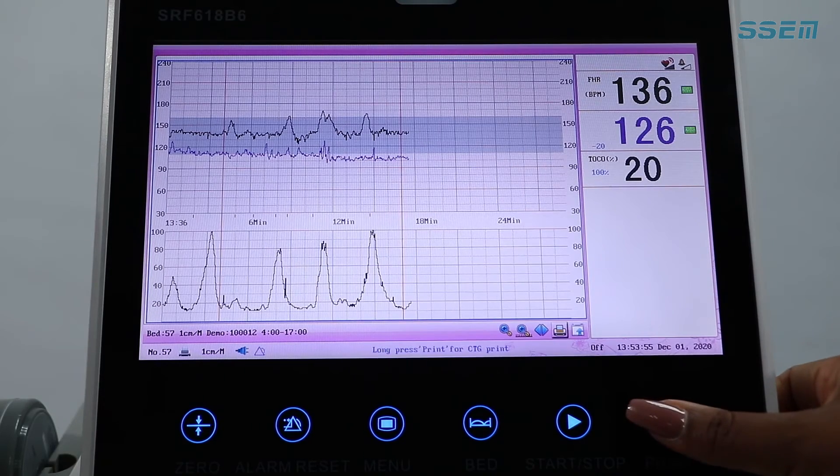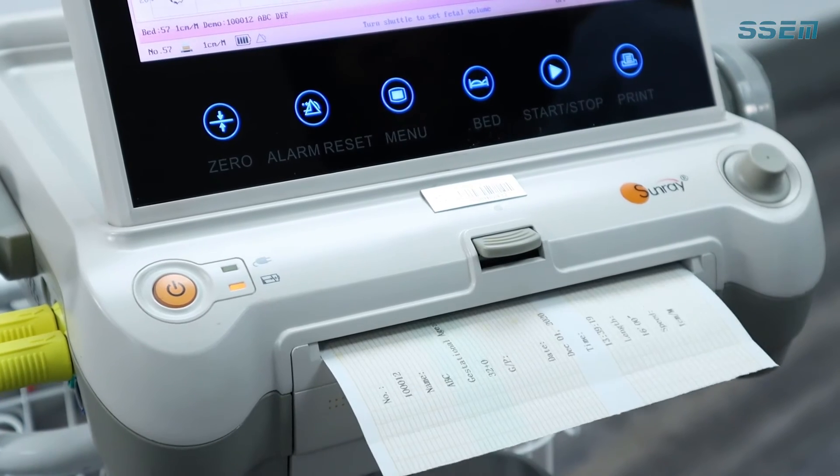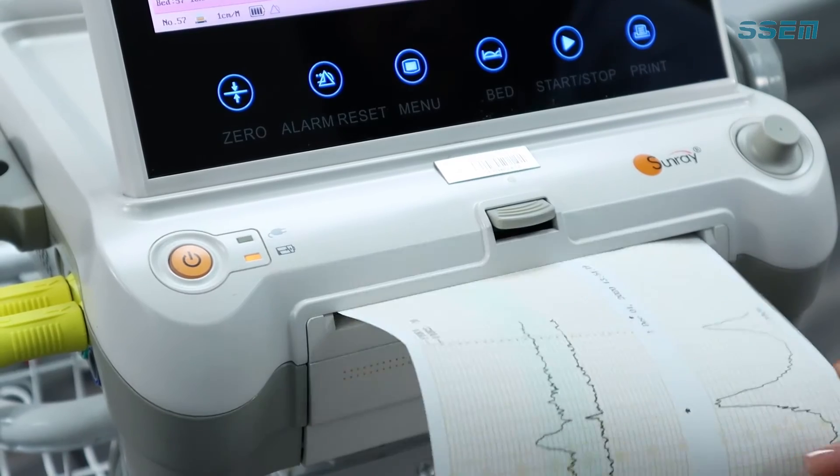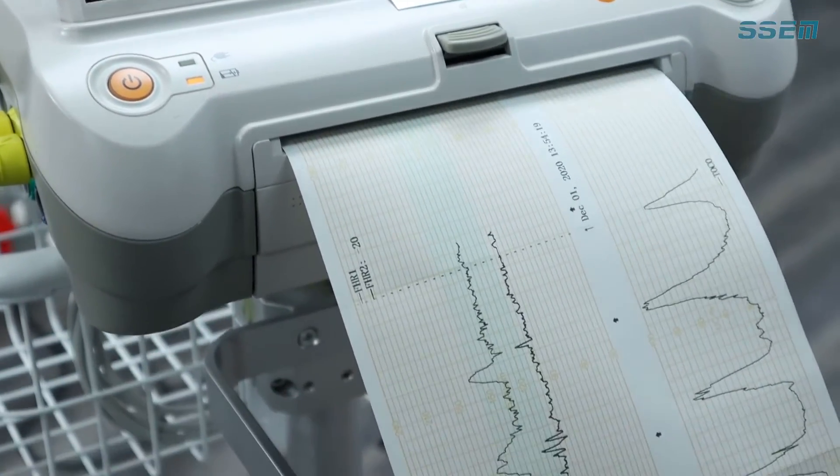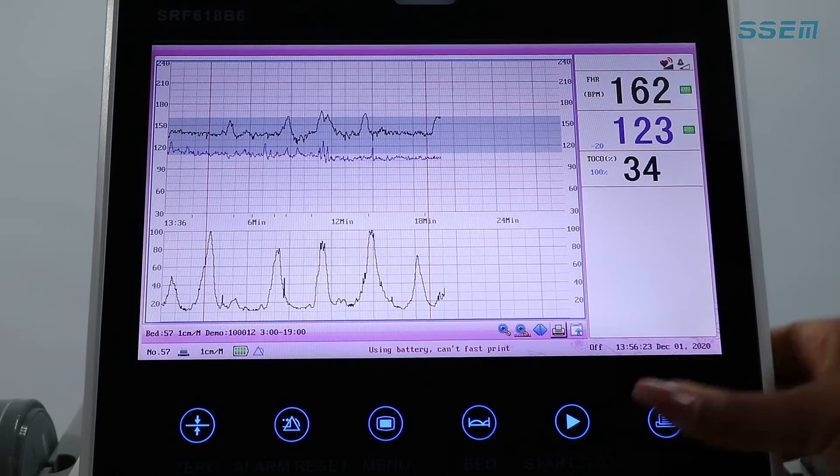Press and hold the big blue print button. Note that fast print does not work on battery.